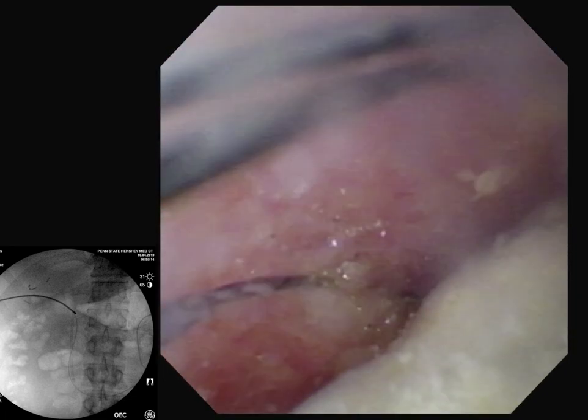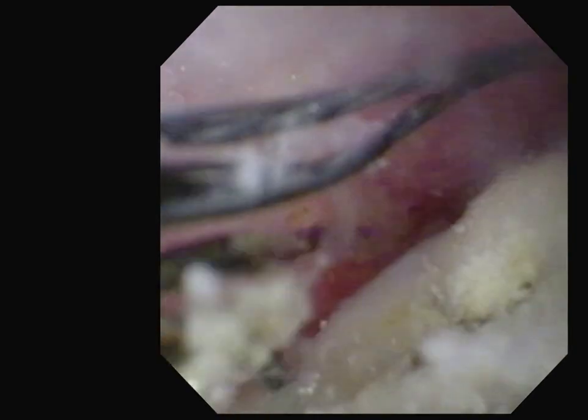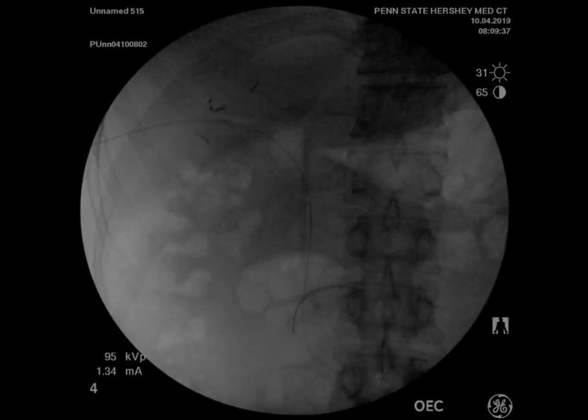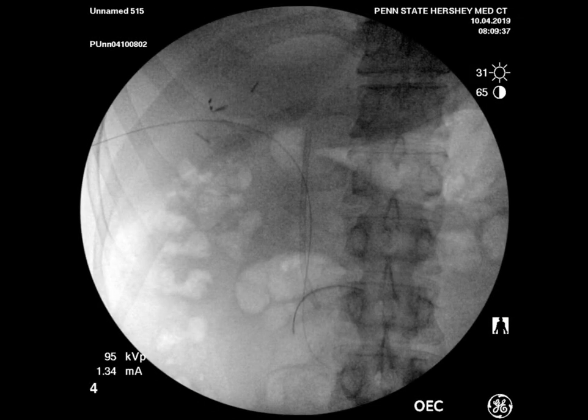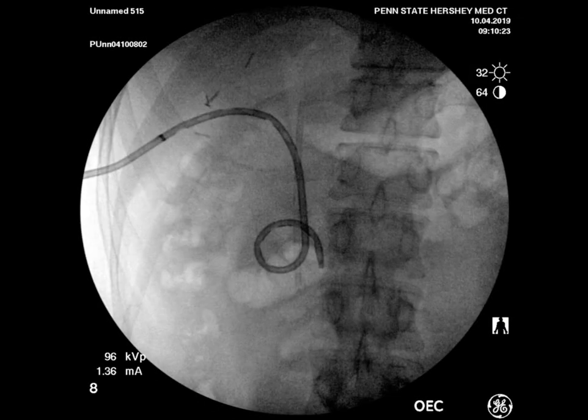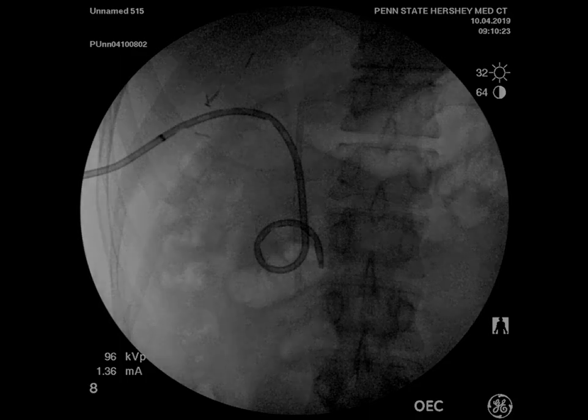The procedure was terminated at this time, and a biliary drain was replaced over a wire. After collaboration with an institutional urologist, we elected to apply laser lithotripsy one week later.